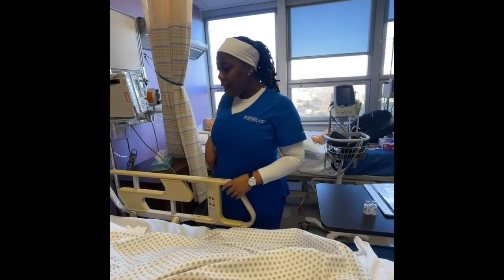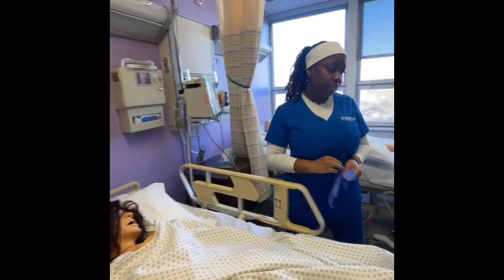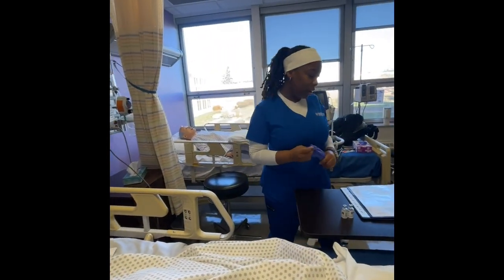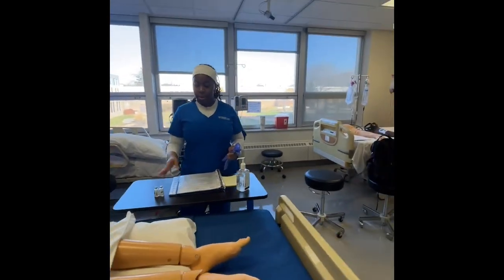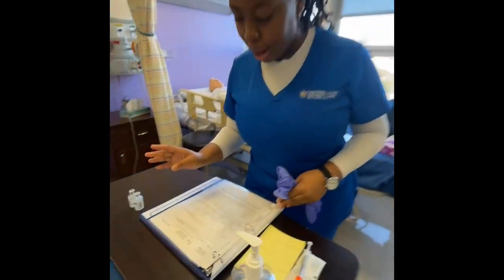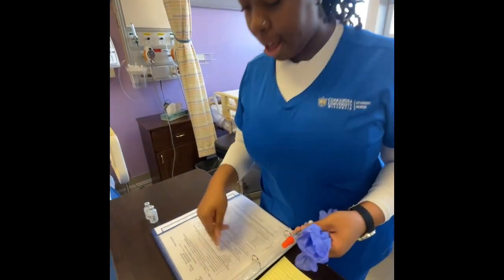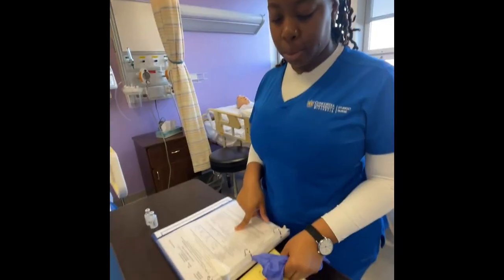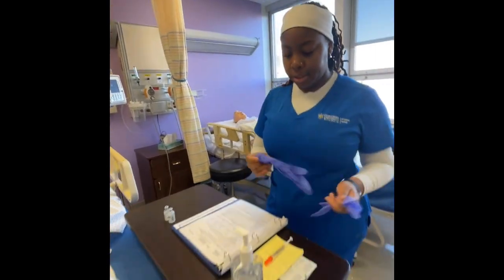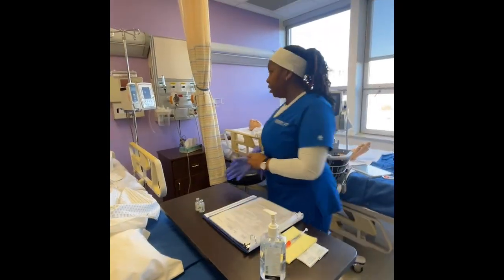And then, do you have certain areas you administer your insulin when you're at home? In my belly. All right, so we'll use that today. Before administering the insulin, I would do my third med check. So I would make sure that I have NPH regular and then the appropriate amount of insulin that we'll be giving Martha. I would make sure I closed her curtain just to give her some privacy.